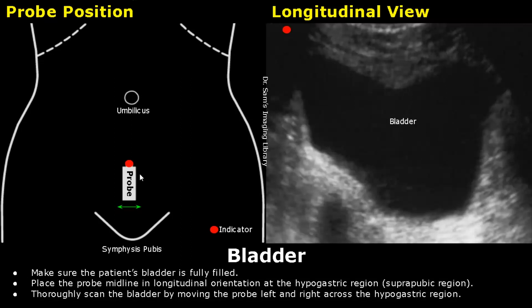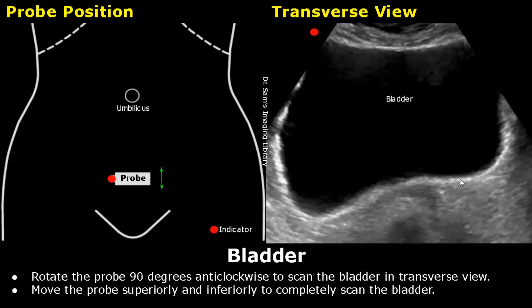Thoroughly scan the bladder by moving the probe left and right across the hypogastric region. Then rotate the probe 90 degrees anti-clockwise to scan the bladder in the transverse plane.